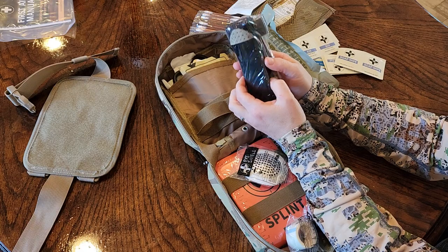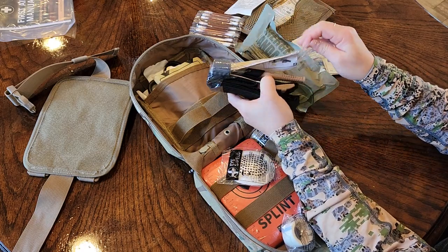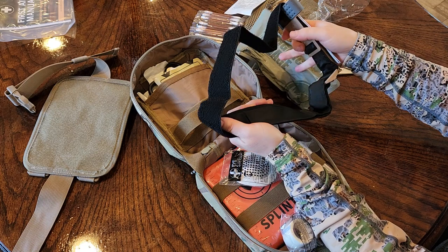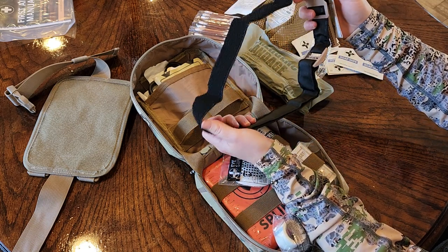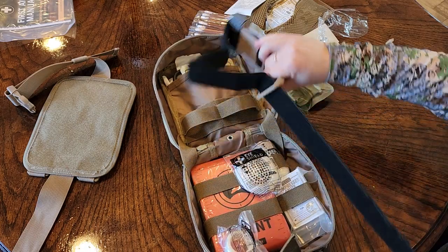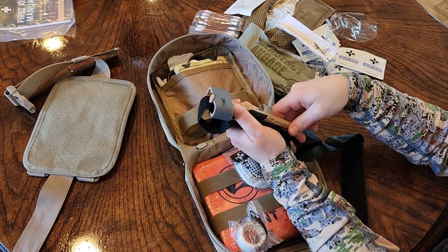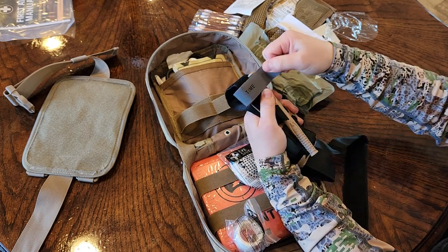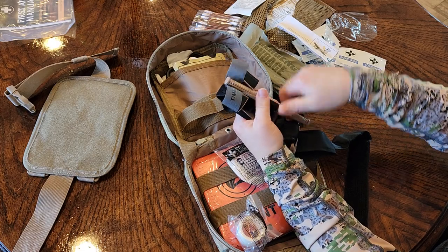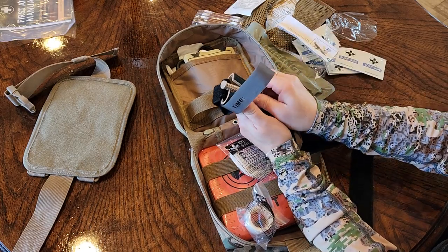It's well, being if it doesn't break. You and I have seen them break before. But sometimes with people, I've noticed it is hard to control the bleeding even with the tourniquet, so it's nice you have the extra compression wrap. You just stick your limb in here and it's like a belt. You just open this and pull tight until they keep screaming, because when they start really screaming, you know you're getting it on tighter. And then there's your time, or you just write it on their forehead, doesn't matter. And then this is just a little bit of extra compression. You just put that there, seal it back up, and ta-da! Hopefully your hemorrhaging has been controlled.